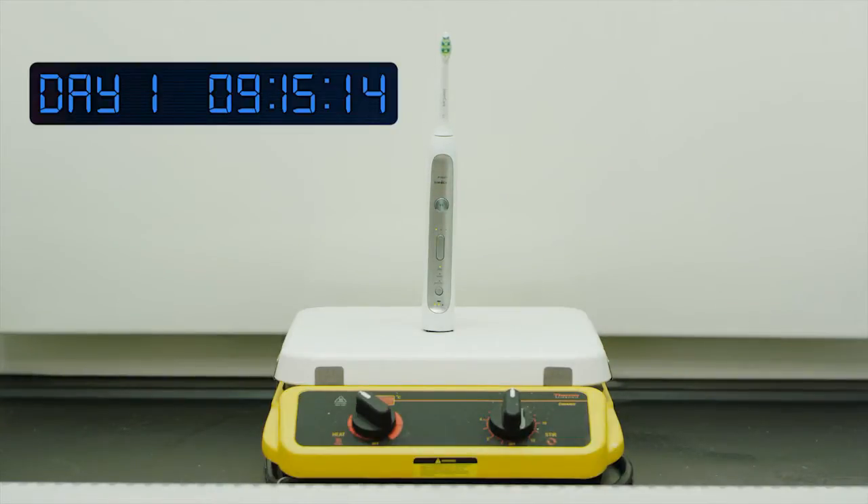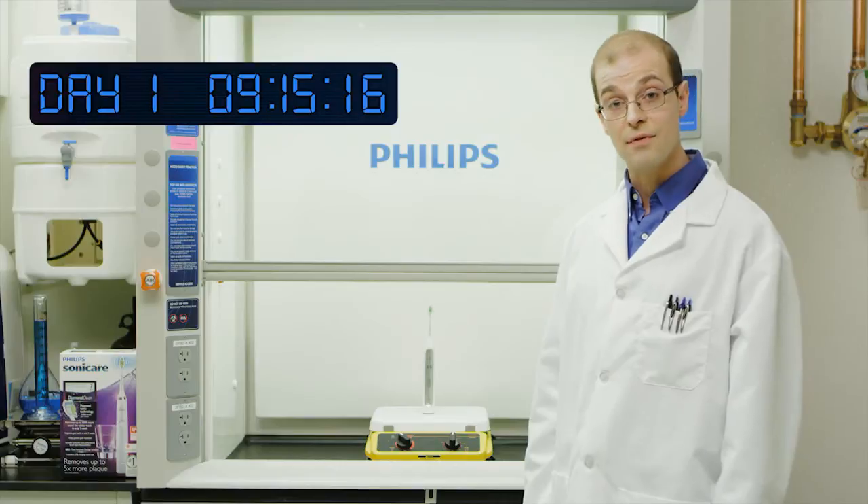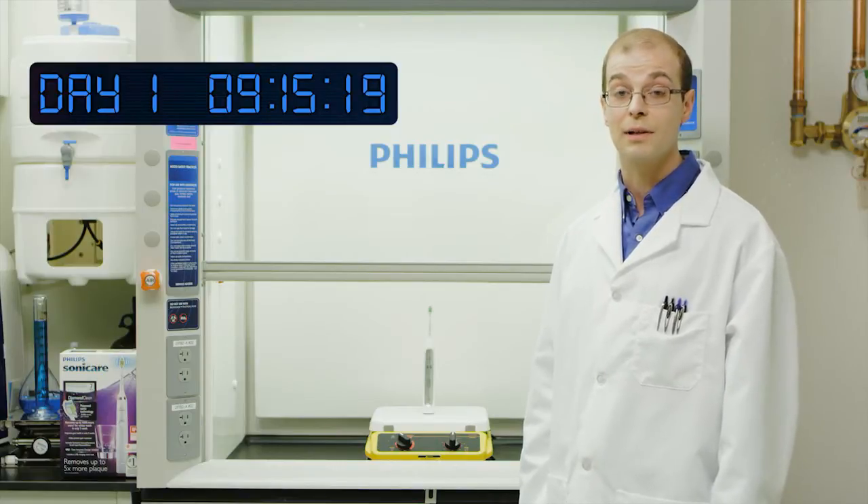We'll start with a fully charged toothbrush, and then we'll turn it on for two minutes every day, twice a day, to see how long the battery actually lasts.